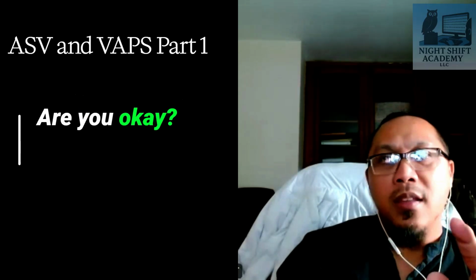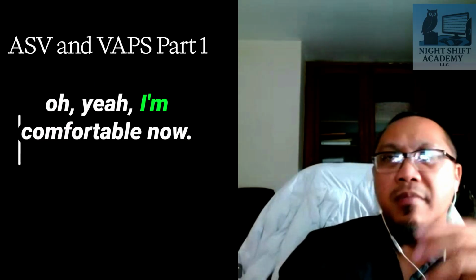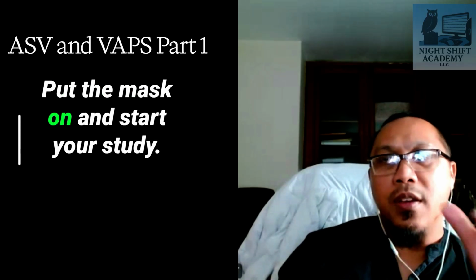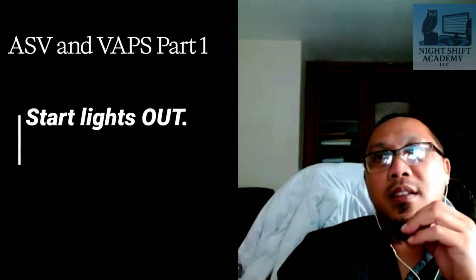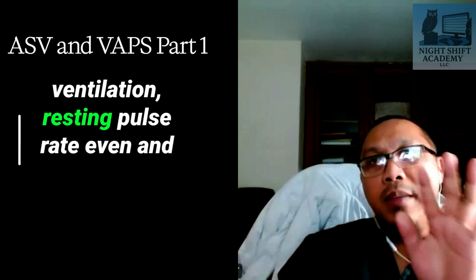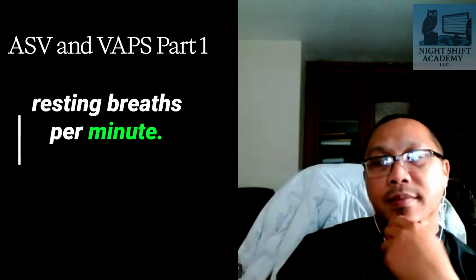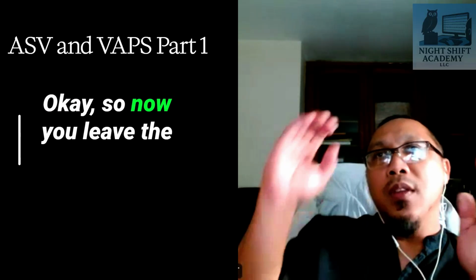Are you okay? Do you feel like you're getting a little sleepy? Oh, yeah, I'm comfortable now. Okay, then we can start, right? Put the mask on and start your study. Lights out. So now the patient has a resting minute ventilation, resting pulse rate even, and resting breaths per minute. Okay. So now you leave the patient alone for 40 minutes.